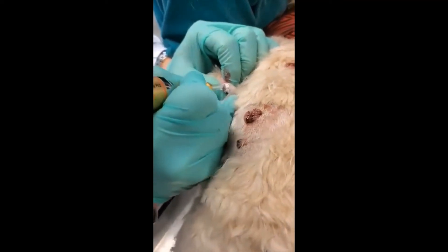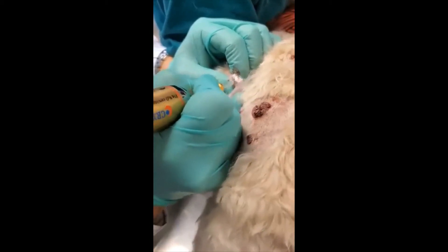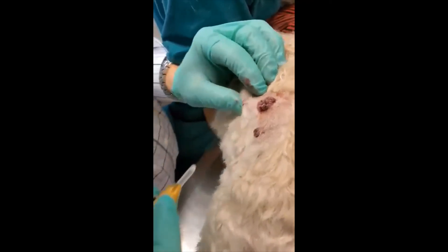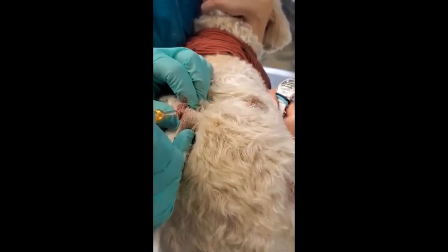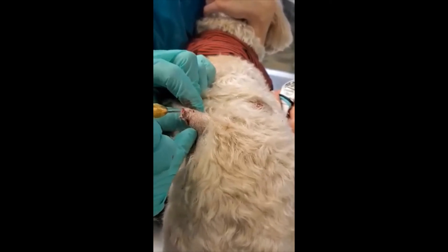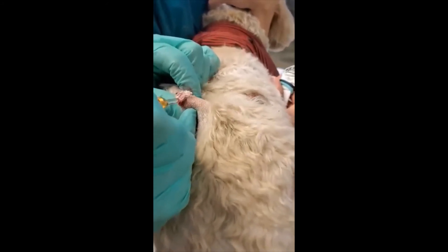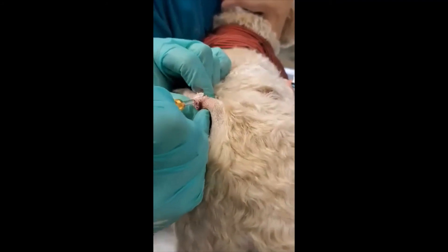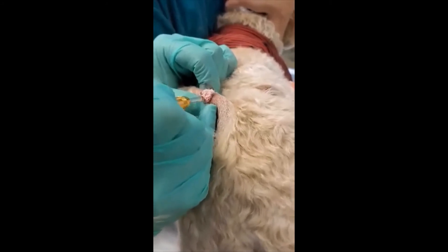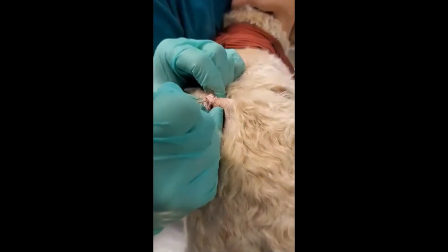The overall response is probably 85 to 90%, and client satisfaction is very high. There is minimal to no post-cryo complications. Occasionally, we'll find a dog will lick at these lesions, and so we'll use a body stocking or an Elizabethan collar to prevent self-trauma during the necrosis and healing phase. Client satisfaction is very good, patient acceptance is excellent, and post-cryo scarring is minimal at best.